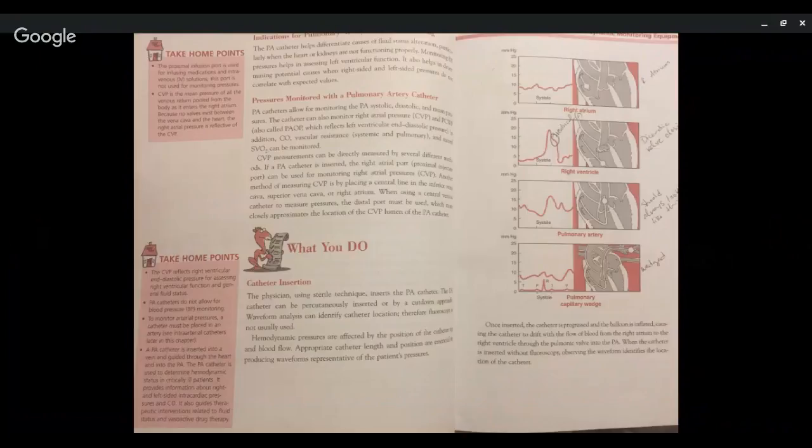What you do: catheter insertion. The physician, using sterile technique, inserts the PA catheter. The PA catheter can be percutaneously inserted or by a cut-down approach. Waveform analysis can identify catheter location, therefore fluoroscopy is not usually used. Hemodynamic pressures are affected by the position of the catheter tip and blood flow. Appropriate catheter length and position are essential in producing waveforms representative of the patient's pressures.